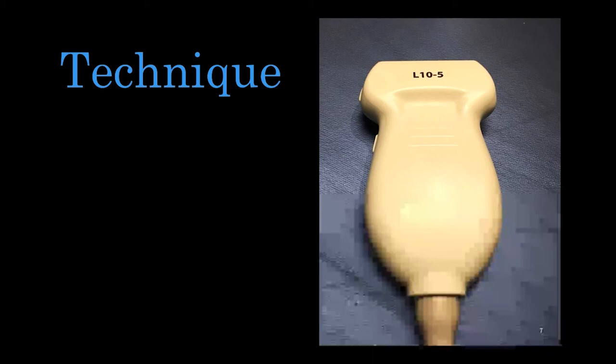The transducer of choice is the high-frequency linear transducer. You want to acquire these images in two orthogonal planes, one in the long axis and one in the short axis. Make sure to sweep through the entirety of your target soft tissue, whether it be an infection or a foreign body. The image surrounding the anatomy itself can be useful to demonstrate additional anatomic landmarks or nearby vascular structures. And when the patient can tolerate it, sometimes a little compression can help to assess the contents in the abscess itself. Lastly, you want to also optimize your image by using color Doppler to assess the structure itself.